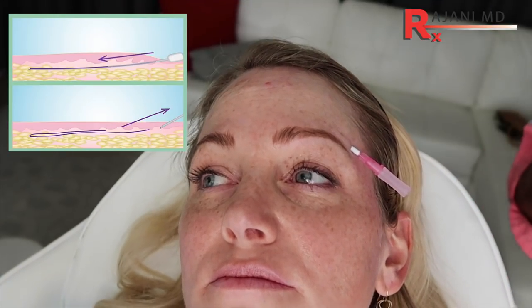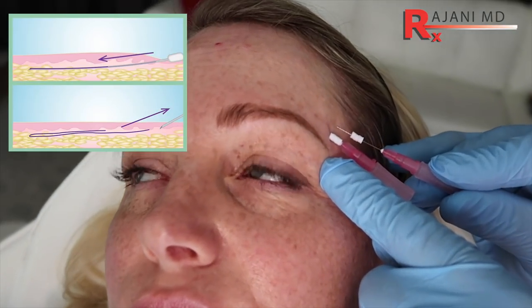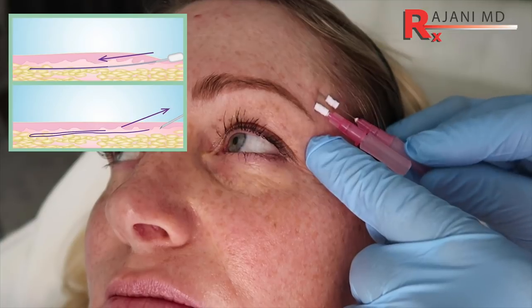Here we're putting smooth PDO threads in above the brow, and this is a marathon, not a sprint. While you get an immediate effect, the reason I'm doing it is for the long-term collagen building above the brow. Over time these lines will fade away. I often repeat these smooth threads, and when the lines go away, we don't need to add toxin here.